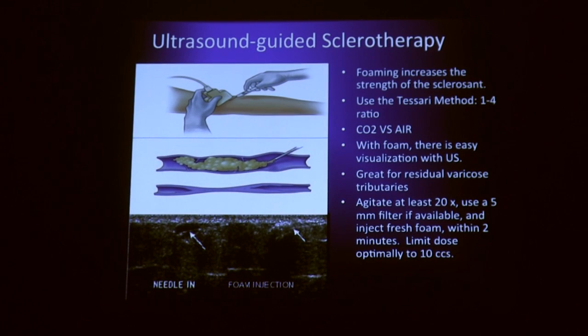Here is your ultrasound-guided sclerotherapy. What we've done here is we use an ultrasound, and we can sometimes close bigger veins that we can't see with the eye, and because they're bigger, they can handle the foam, if you will.